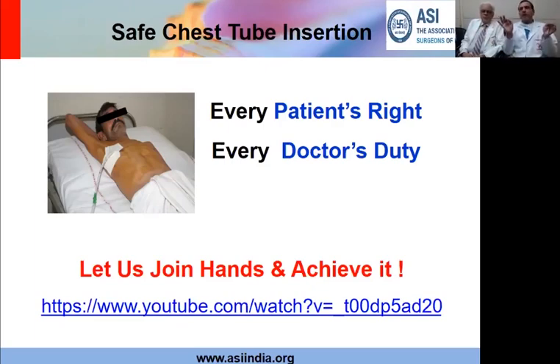For me, the single most important factor that I want to see in the chest X-ray after insertion is lung expansion. If the lung is expanded, friends, all air leaks will stop. If you get complete lung expansion and there are some minor air leaks, those are usually from the parenchyma, periphery. 100% of peripheral air leaks will stop if the lung is expanded, because the lung goes and sticks to the chest wall and forms a buttress there and it stops there. So there is no suction.